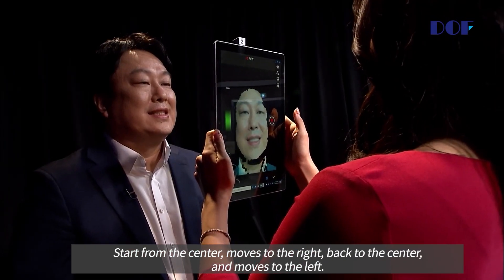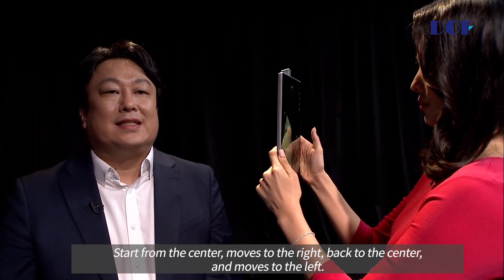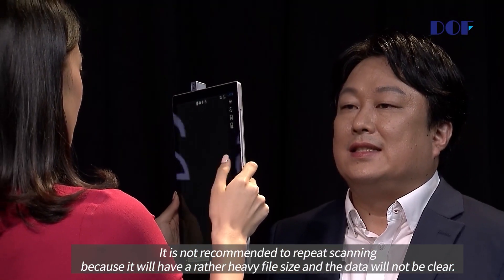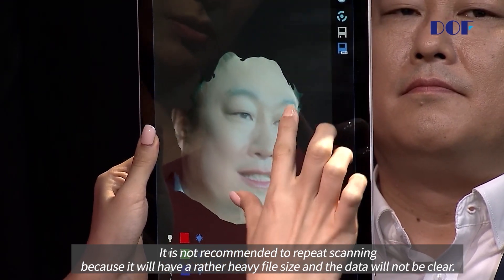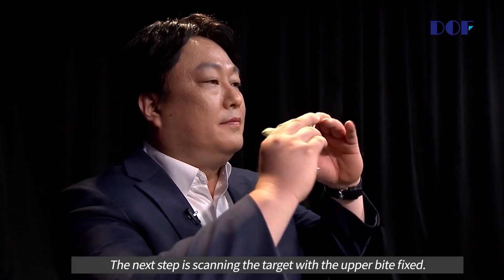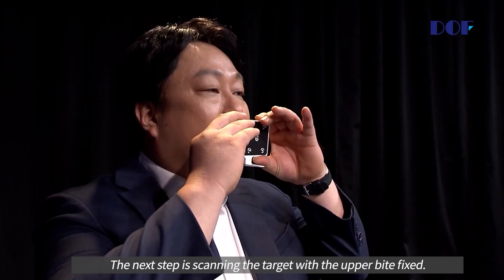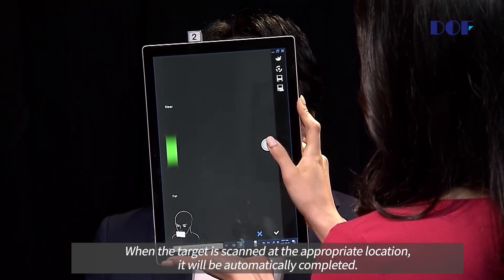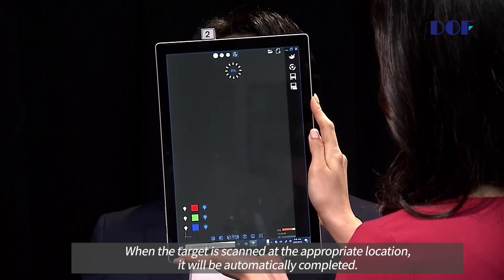Scan the face as follows: start from the center, move to the right, back to the center, and move to the left. It is not recommended to repeat scanning because it will result in a heavier file size and the data will not be clear.